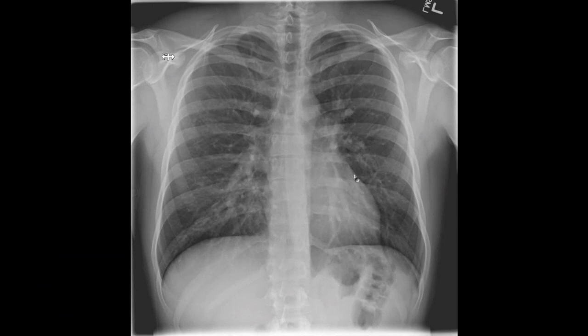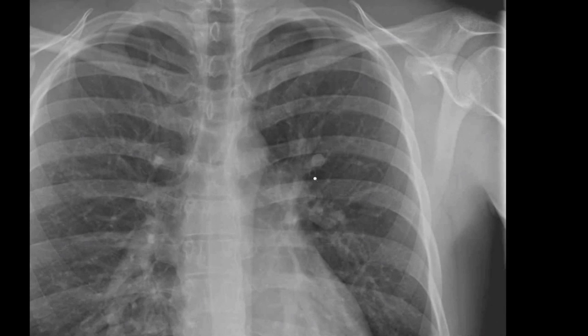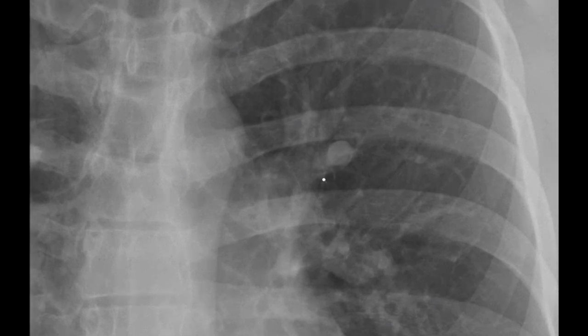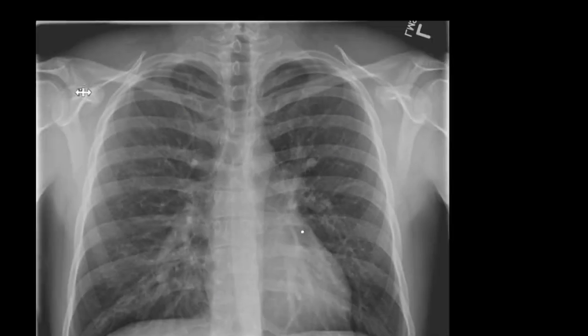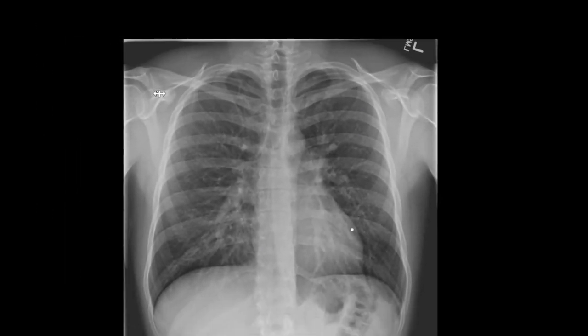And if you wanted a case to talk about the notion of evaluating a bronchoarterial bundle, where you see the artery and the bronchus on end, and you compare the size of the artery with its companion bronchus, typically we teach, of course, that they're typically the same size. And if we really are seeing this on end and this on end, and we seem to be, then this seems to be bigger than that. And if you happen to see that, then you have to ask yourself, is that just a fake out, or are these vessels really a little bit too big?